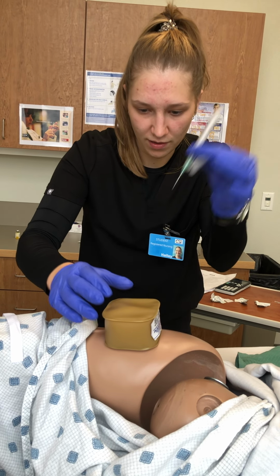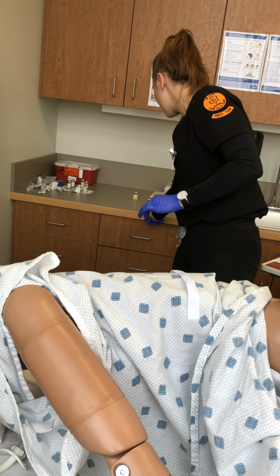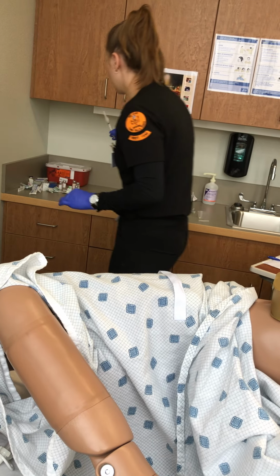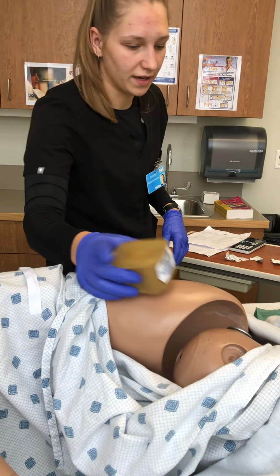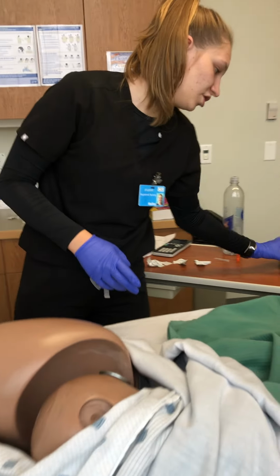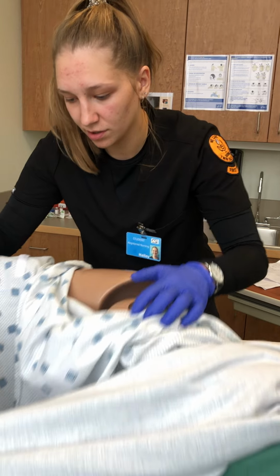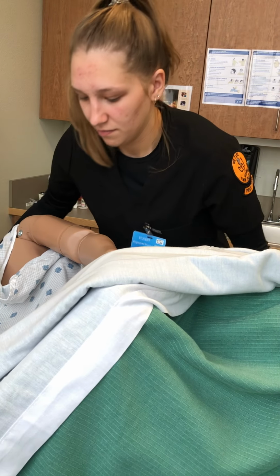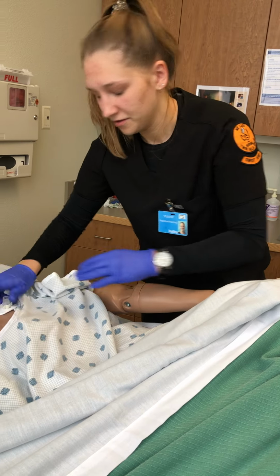Okay, I'm going to go ahead and pull that out, put on the safety thing for the needle, and go ahead and dispose of this. I would put on a Band-Aid and cotton swab, and on all of the injections I would have stabilized it while I was injecting it. So I'm going to go ahead and flip Betty back. Put her trach back in.